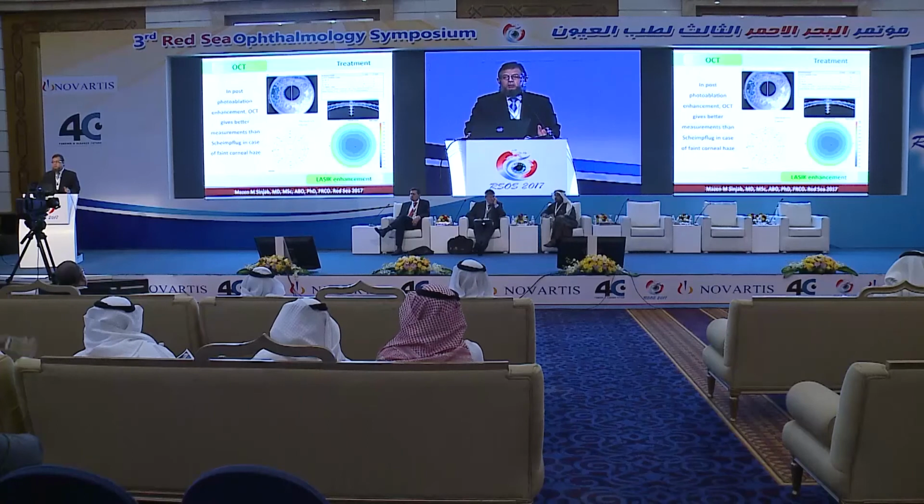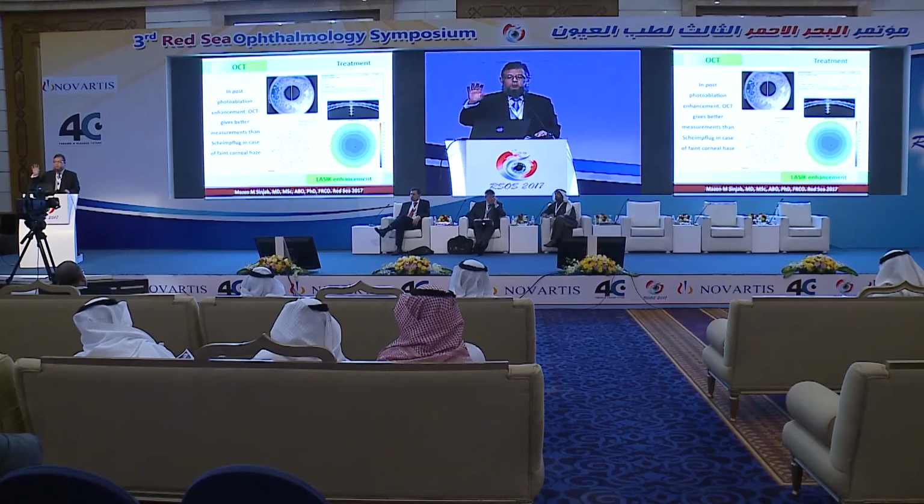For LASIK enhancement, usually I do LASIK enhancement by PRK. So I am going to do PRK over the flap. Now, the best way to evaluate the anterior corneal surface in this case, apart from topography, of course, Placido topography, not tomography, is OCT. It can give you the structure of the anterior part of the cornea, and it can tell you whether there are irregularities and what the thickness of the epithelium is, and you can decide according to that.